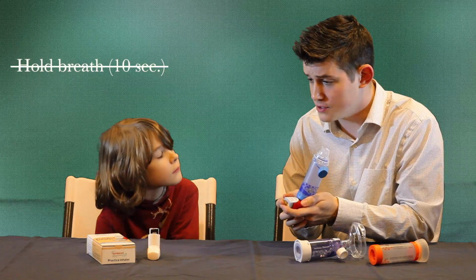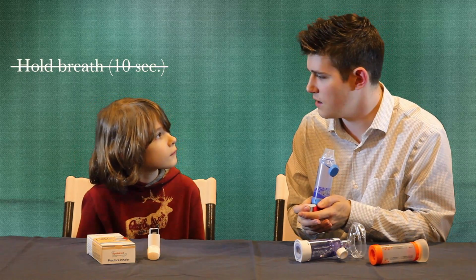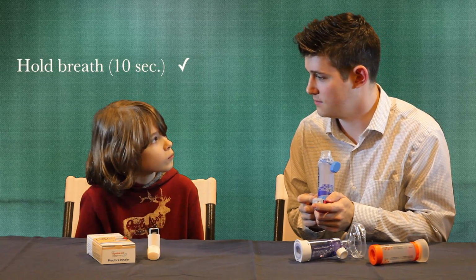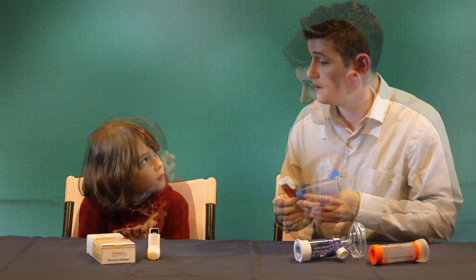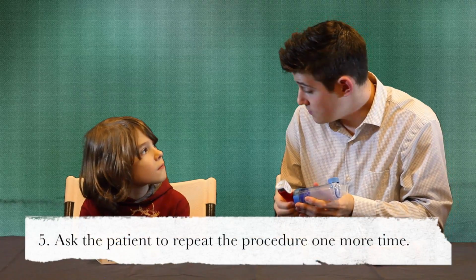And then after that, just make sure you hold your breath for a full 10 seconds. I'm not sure if you did a full 10 seconds or not, but next time, try to hold it and count to 10 in your head, okay? Otherwise, you did a really, really awesome job. Now that we've practiced, let's do the whole thing one more time, and then you're done.